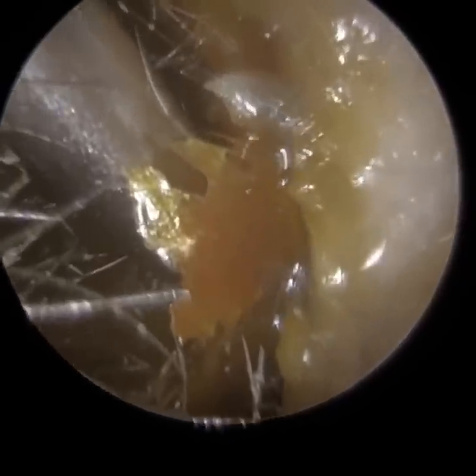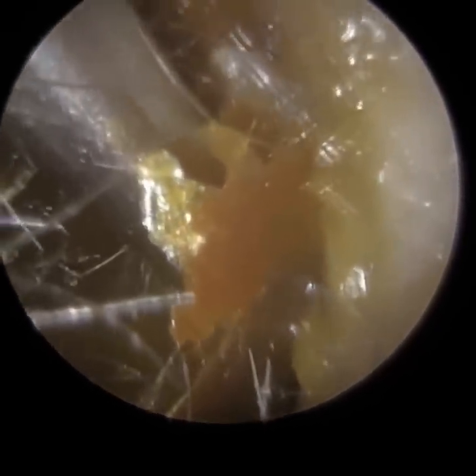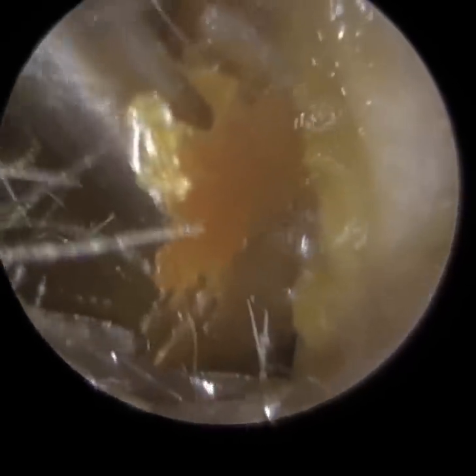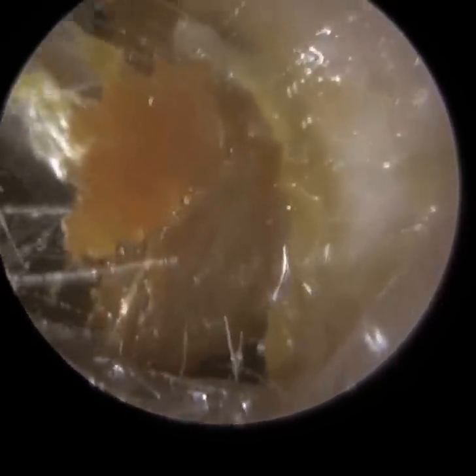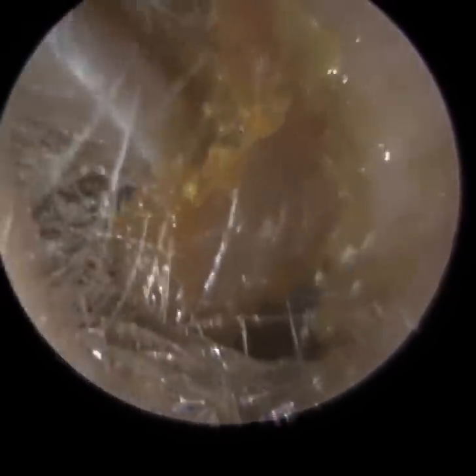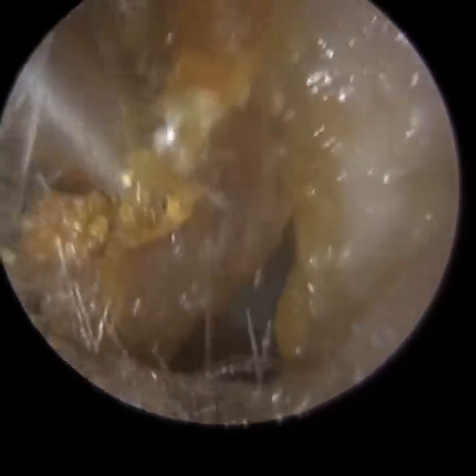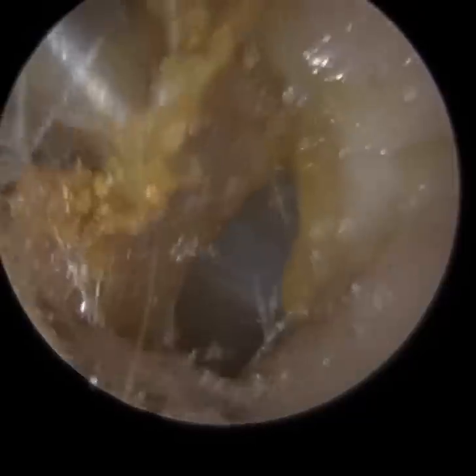Children typically suffer from glue ear — that's the condition. To prevent fluid build-up, which can be a chronic problem until they grow out of it — and some children never do — a grommet is inserted as a short-term measure to allow air to enter the middle ear space and any fluid to drain out. You can see here we're at a stalemate — I've got a suction grip. The patient had been poking inside their ear with a cotton bud. Where I am now is the indentation. I've got a really good suction grip. If I move too quickly I'll lose the grip, if I push further I'll push the wax back in. We're just going to wriggle this out — you can already see the eardrum at the bottom in the distance.